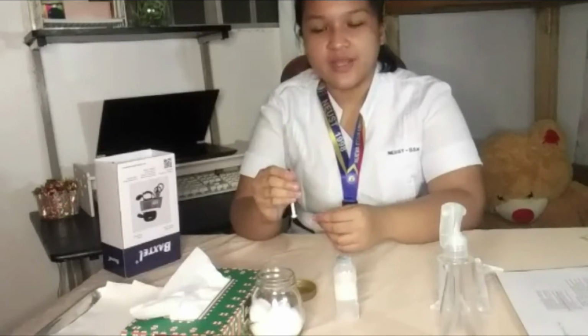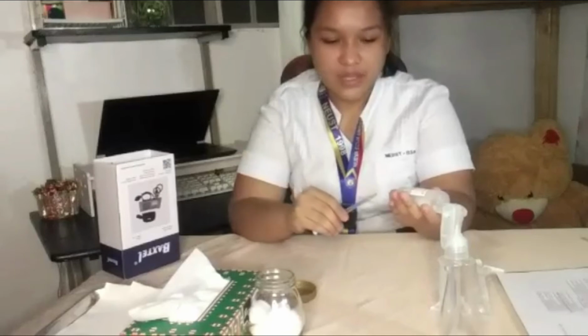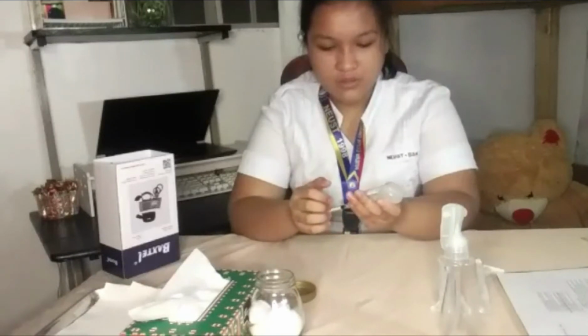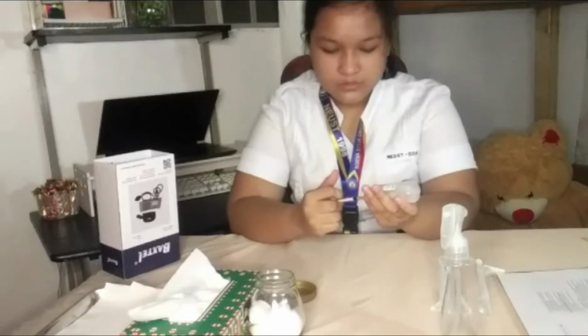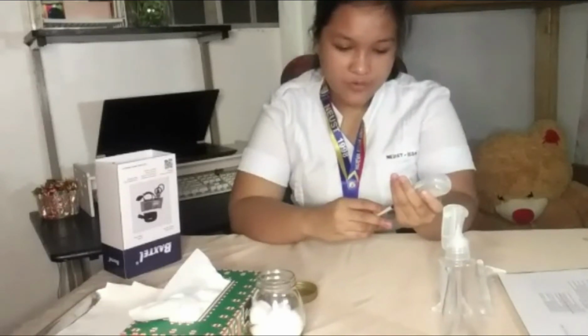Now that I have aspirated the air, I am going to inject it into the vial, bevel up. After injecting the air, I'm going to get the desired amount of medicine that I am going to inject for my patient.